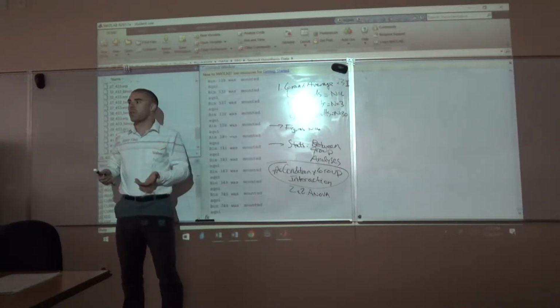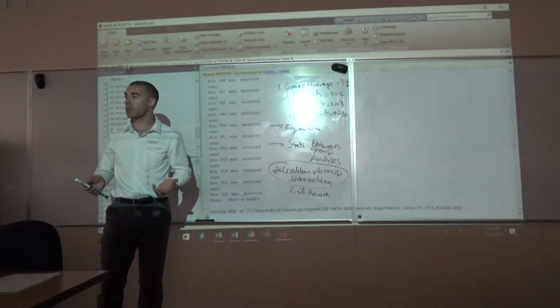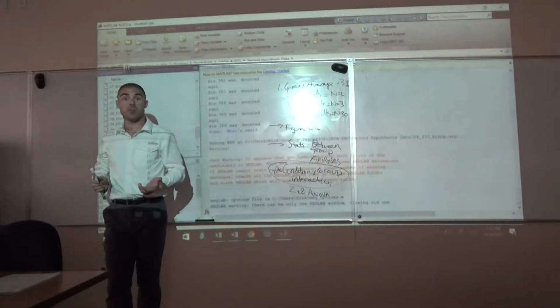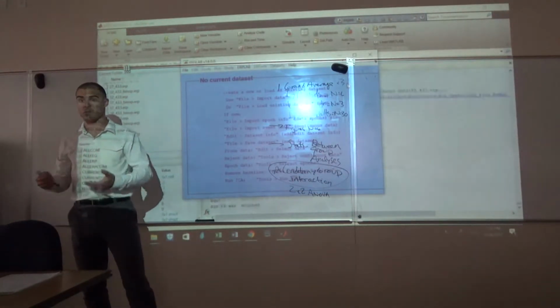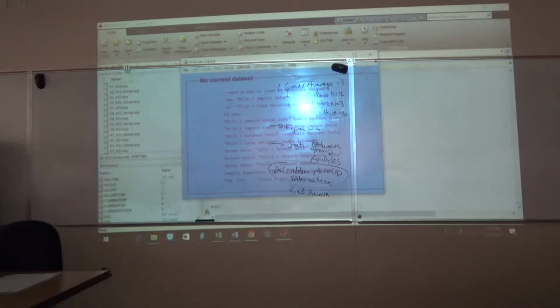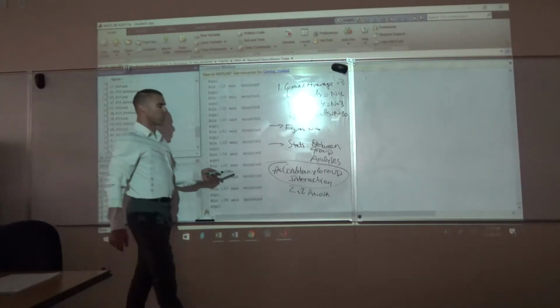It's just a way of conducting multiple t-tests at once. You guys remember that? Has anybody here not taken statistics? Okay, good. So at least we have that foundation. We'll get to kick some of the dust and rust off if we need to. We're going to work specifically on how to identify this condition by group interaction.